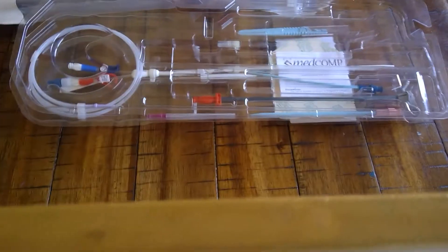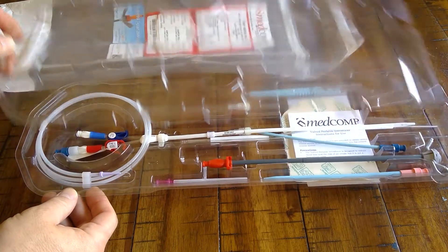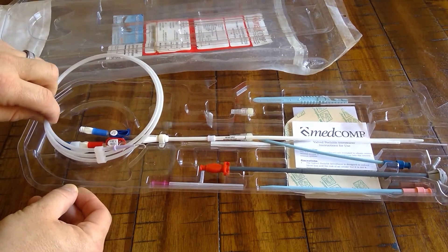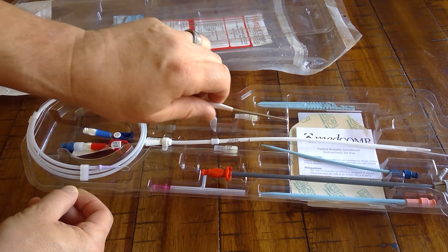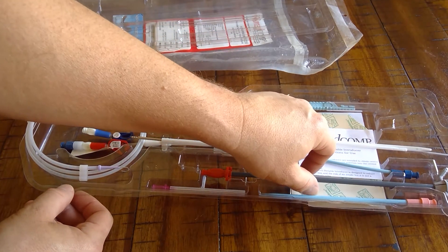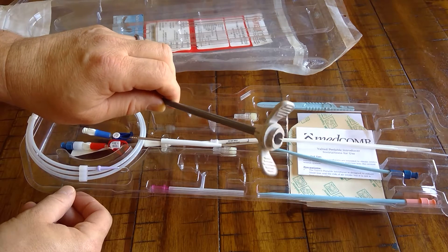It comes in a 14 French and 16 French in various lengths. This is what the kit looks like. It comes with a 0.038 J-tip guide wire, 18 gauge needle, caps, a tunneling device right here, a scalpel, dilators, Tegaderm, and an IFU.